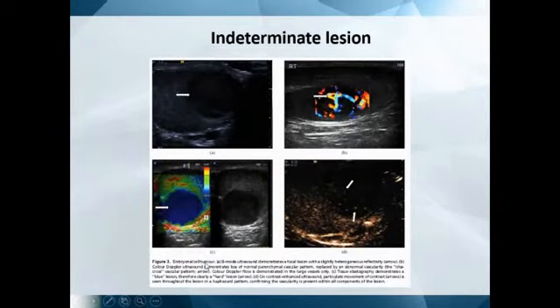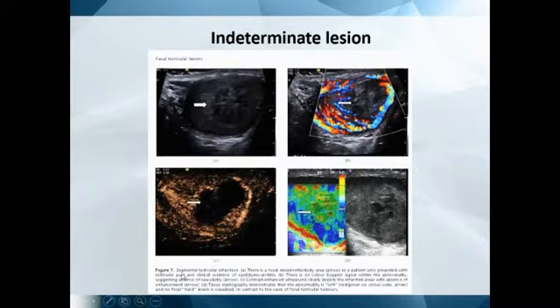This is an embryonal cell tumor, and one of the things we've found with embryonal cell tumors with contrast-enhanced ultrasound is that they're less vascular than any other germ cell tumor, but because of the technique, you'll be able to see single microbubbles traversing that tumor, and you know it's not avascular, and combined with the hardness, you know you need an orchidectomy.